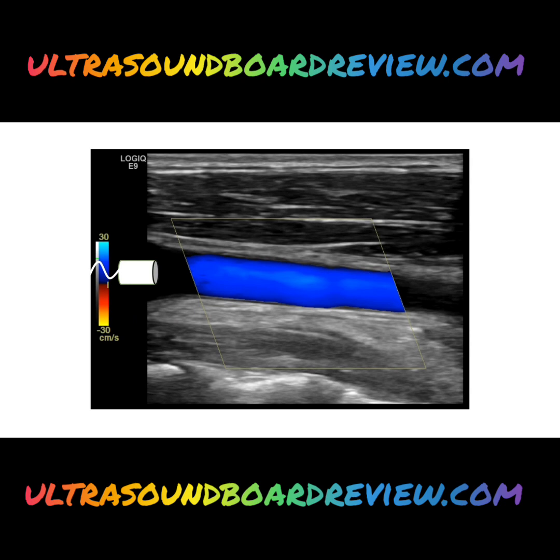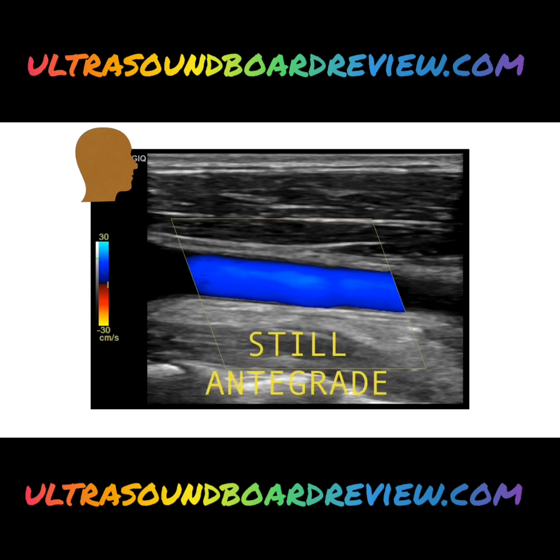And since we've already established that blue is on the top and the top is going towards our transducer, this is the direction of our blood flow. Our orientation is correct, so the patient's head is on this side. Our flow is still antegrade. Hopefully the flow is still antegrade, you guys are still with me. Okay, let's do another one.